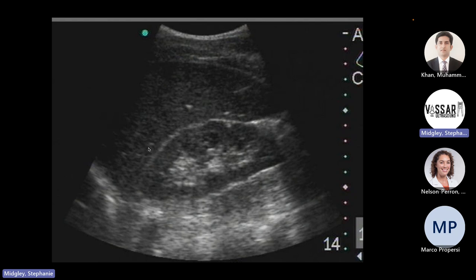Five places we look for is above the diaphragm. So that's your pleural effusions or pneumonia. You're looking below the diaphragm. So in the liver side, if you have fluid between the diaphragm and the liver, it's more suggestive of like cirrhosis and more chronicity to it, because normally the liver is very adherent to that diaphragm. And so if it's acute blood, I wouldn't really expect it to be tracking up above the liver.